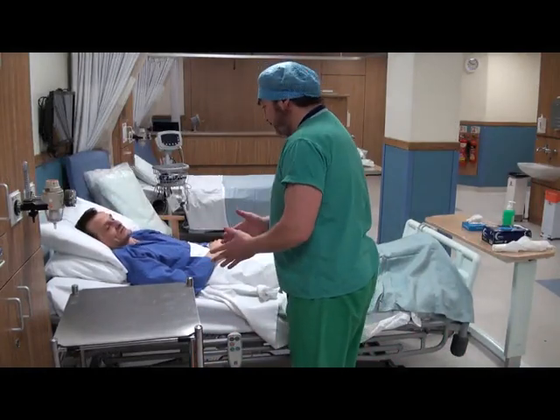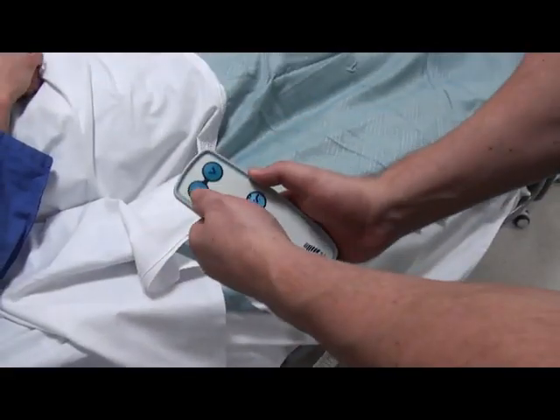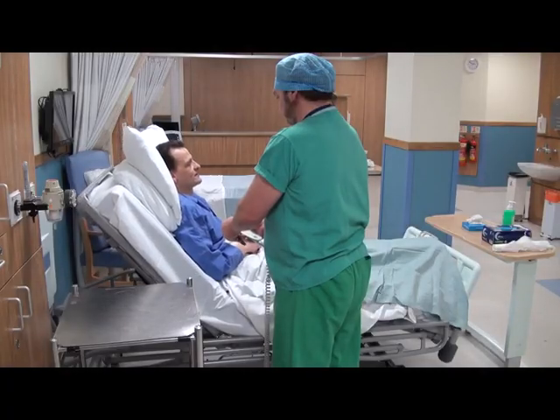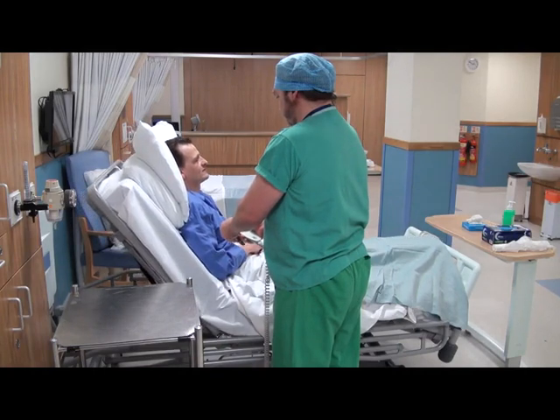Positioning is crucial for this procedure. Position the patient so they are sitting up or semi-recumbent. The head should be in the midline position, flexed slightly forward and supported with a pillow.